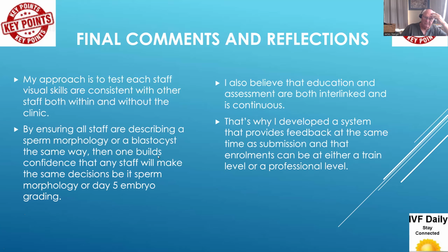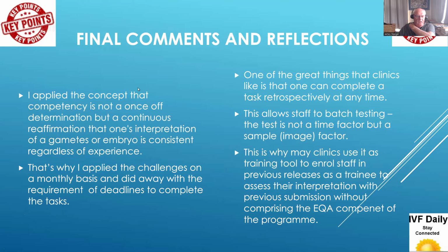I also believe that education and assessments are both interlinked and continuous, and that's why I developed a system that provides feedback at the same time as submission, and that enrollments can be either at a training level or at a professional level. I've applied the concept that competency is not a once-off determination, but a continuous reaffirmation that one's interpretation of gametes and embryos is consistent regardless of experience.